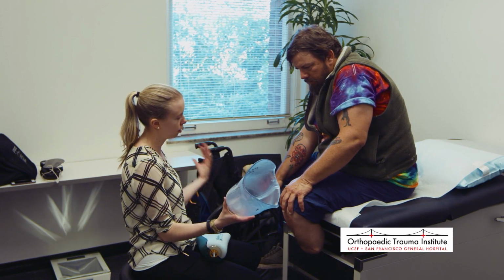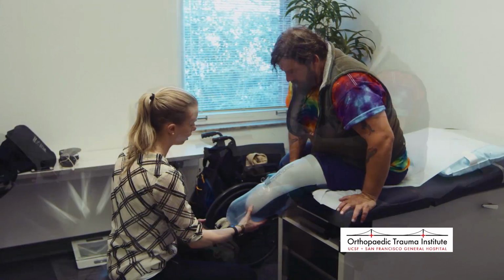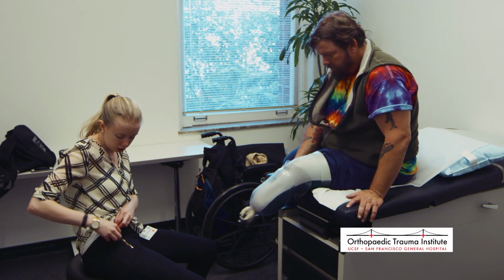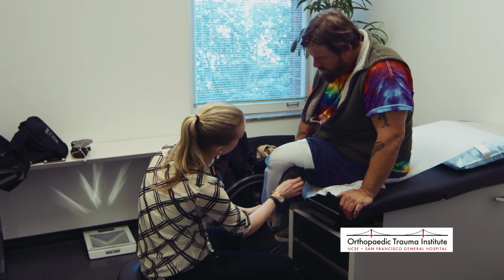Here, Hannah is fitting Don with his initial test socket. During this process, she will try to determine how Don's residual limb fits within the socket and whether or not there are any points of pain or discomfort that need to be accounted for in the final socket.